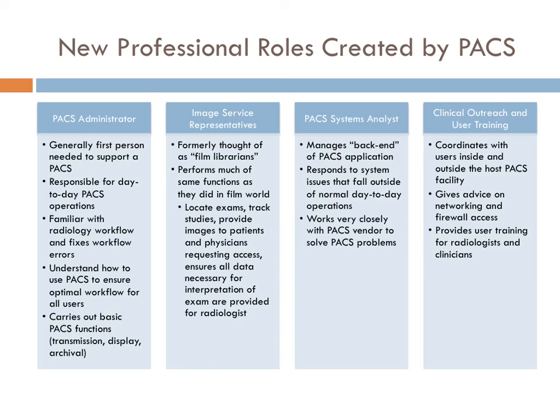Then there is the clinical outreach and user training individual. So whenever a PACS is implemented, the staff has to know how to work it. So if you have this great, awesome new system like PACS, but the staff doesn't know how to use it, it's no good. It is essentially useless. So the trainer coordinates with the users inside and outside the PACS facility and facilitates the training process. They give advice on networking and firewall access, and they provide the training for the RADs and the clinicians as well.